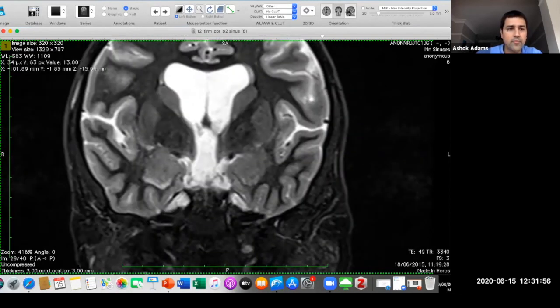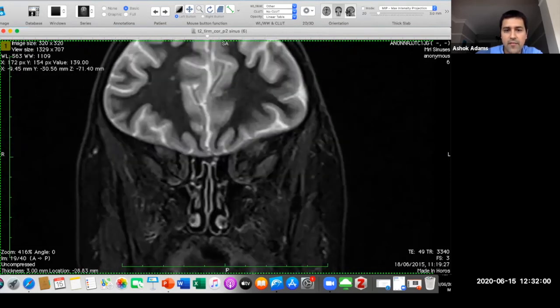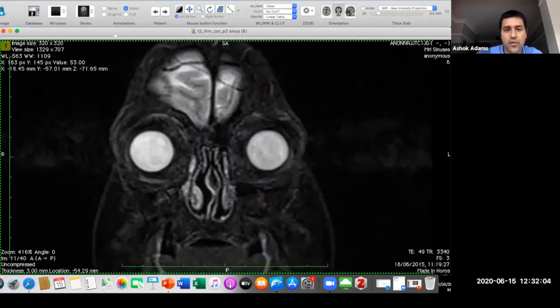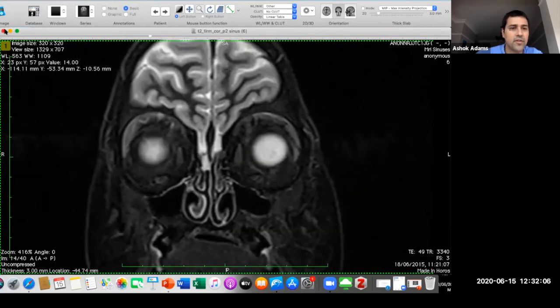So that was just to recap in terms of looking at the olfactory niche. And if you're ever uncertain, I typically have a low threshold for doing MRIs. It's very useful in terms of working out what your problem is.